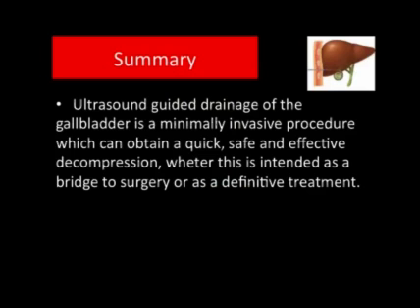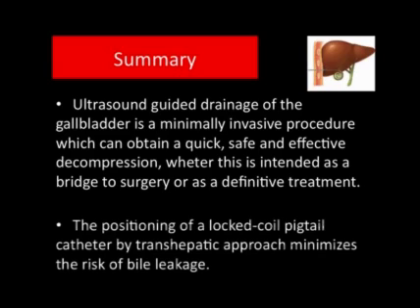In summary, transhepatic ultrasound-guided drainage of the gallbladder is a minimally invasive technique which can obtain a quick, safe, and effective decompression of the gallbladder, whether intended as a bridge to surgery or as a definitive treatment. The positioning of a locked-coil pigtail catheter by transhepatic approach minimizes the risk of bile leakage, a feared complication of cholecystostomy.